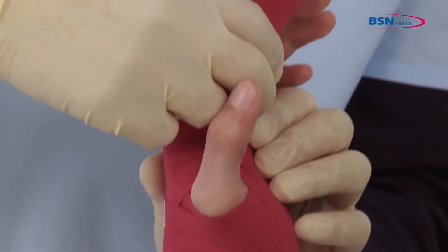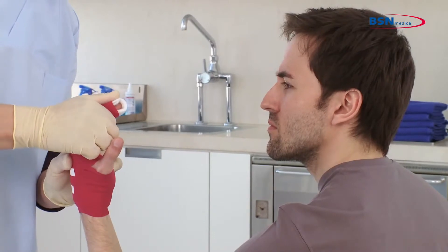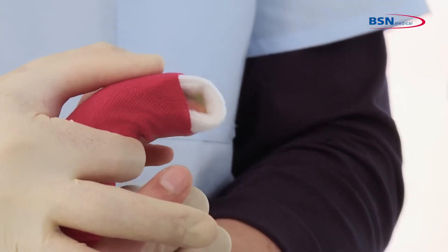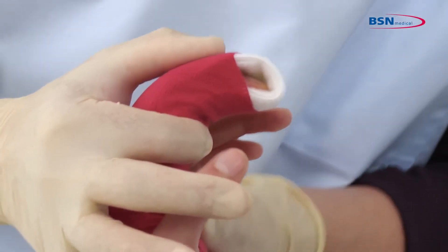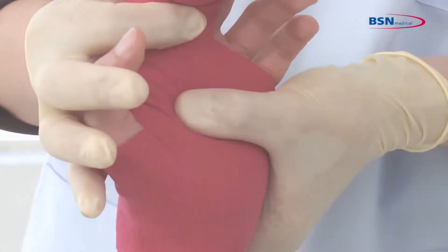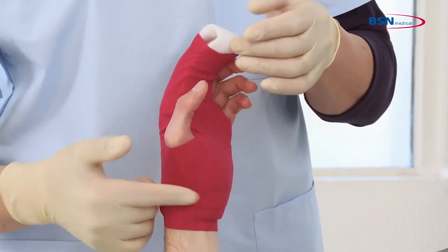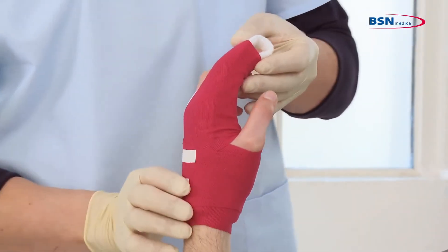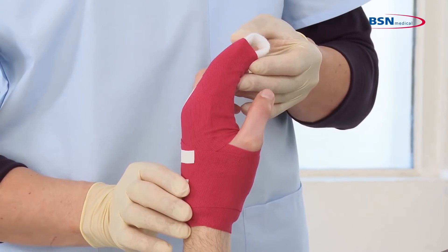Position until the splint is in a rigid position. Mold as prescribed by the physician. Please be aware to make sure wrist flexion is possible if the wrist is not involved. Normally, you flex metacarpals to 45 degrees and the wrist to 20 degrees extension. Then tape down or treat as prescribed by the physician.